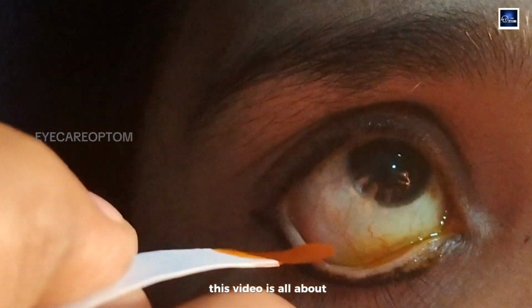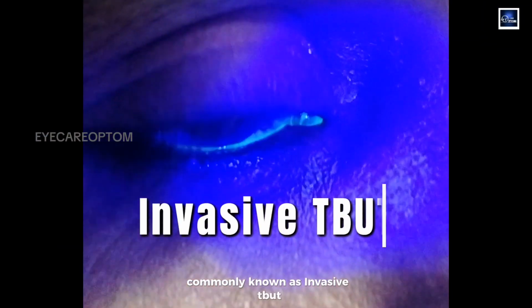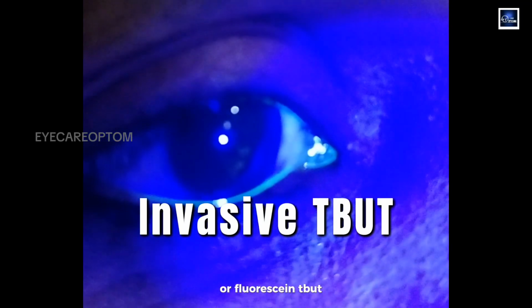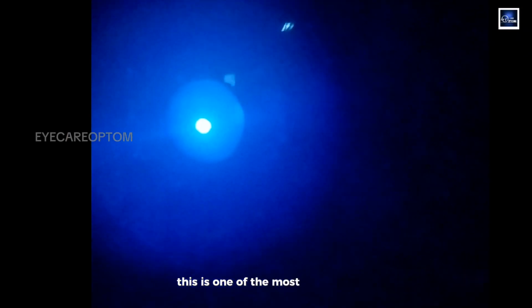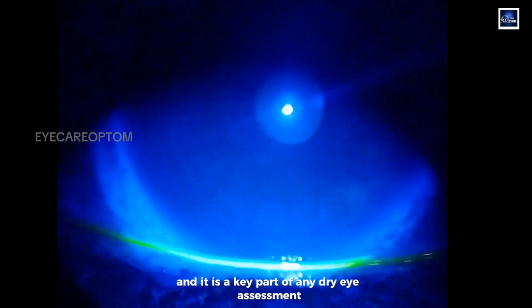This video is all about the invasive tear breakup time test, commonly known as invasive TBUT or fluorescent TBUT. This is one of the most important clinical tests we perform to assess the tear film stability, and it is a key part of any dry eye assessment.